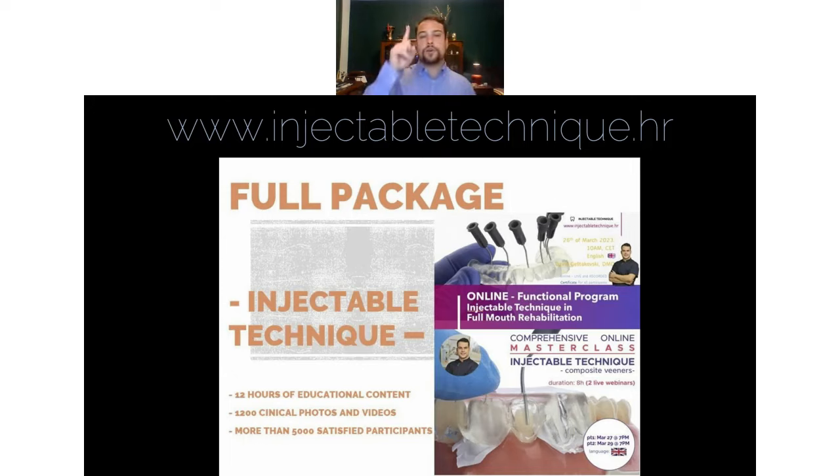Use the cotton buffer in the straight handpiece, because the one on the angled handpiece has a small screw and you can rotate it only in one direction. I like to rotate it in both directions, clockwise and counterclockwise, and this will give you better polishability from both mesial and distal parts.